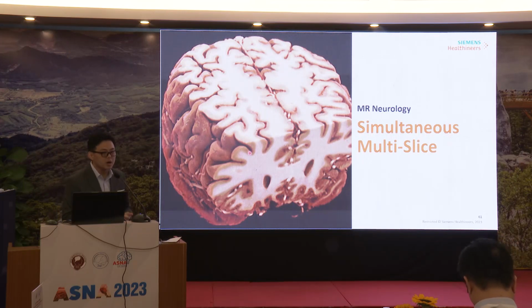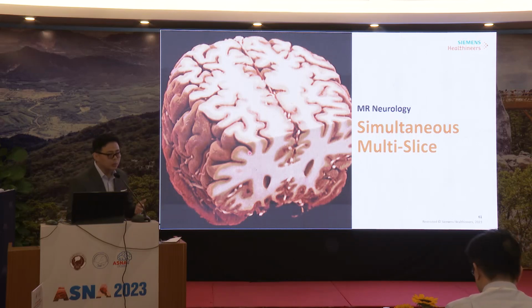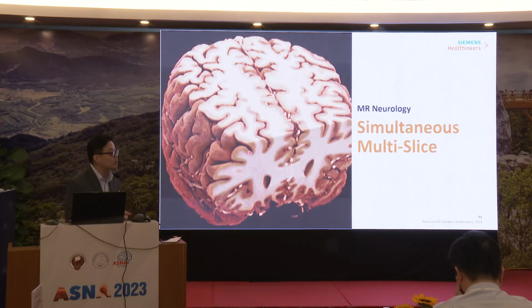Secondly, for functional MRI, like Dr. Kong mentioned, if we do not have a low TR, that means we do not have good temporal resolution, meaning we do not have enough samples. In functional MRI, how do we get the activation map, or know which part of the brain is giving us the activation signal? It is based on statistical difference, if you do so-called task-based functional MRI. So simultaneous multi-slice is able to help us solve all these technical challenges.